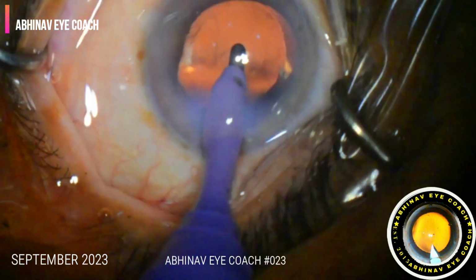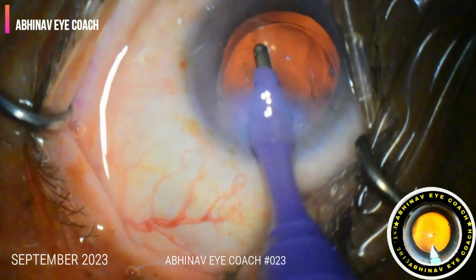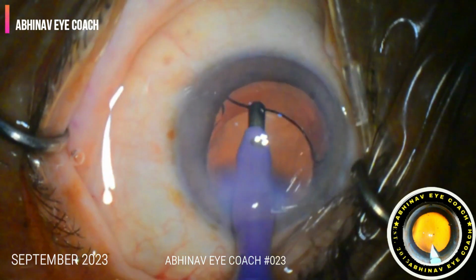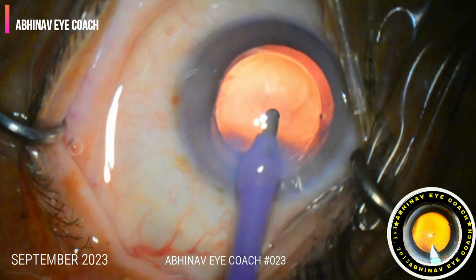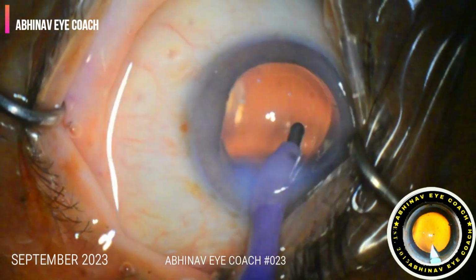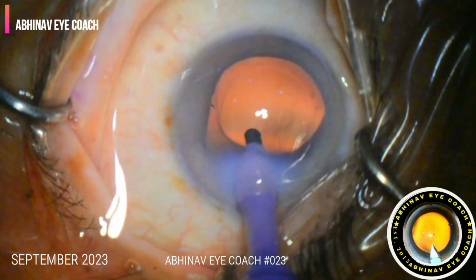So now meticulous aspiration of viscoelastic is done. Viscoelastic is removed from the equator of the bag, behind the lens, in front of the lens, and all the angles of the anterior chamber. So the meticulous viscoelastic removal is performed.